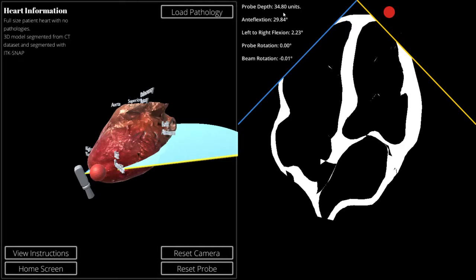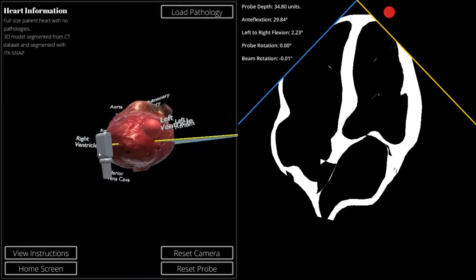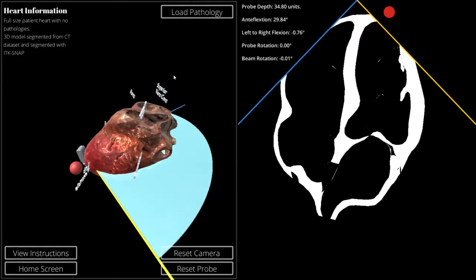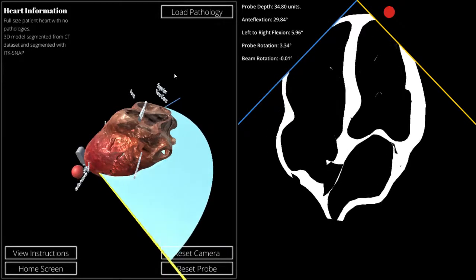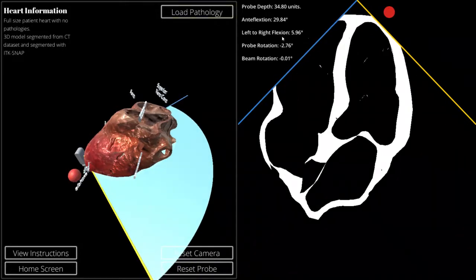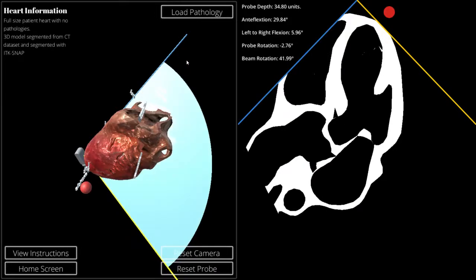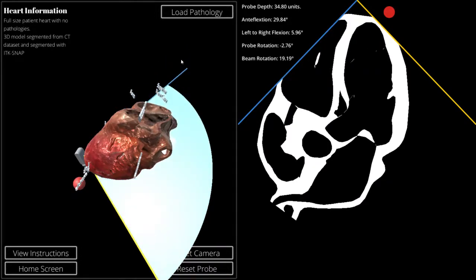So deep transgastric is completely doable. We can see how far we are relative to our start point, the degree of antiflexion that we have in order to attain this view, where we are externally to the heart, how much left to right flexation there is. We can play with that to get a better view. The probe rotation and the beam rotation. The beam rotation is basically zero right now, but we can go all the way through if necessary.